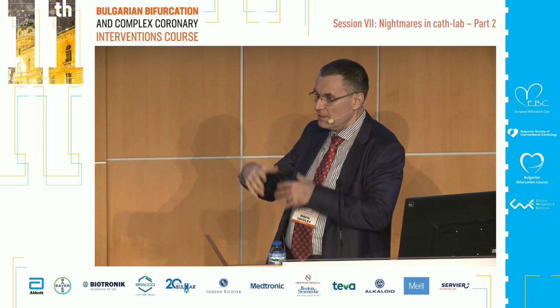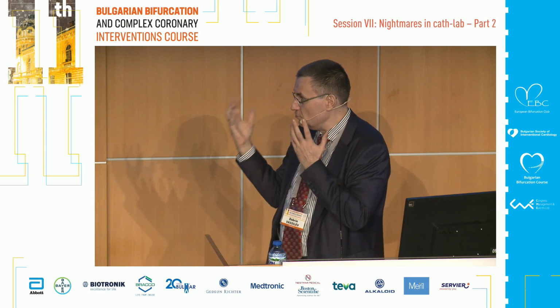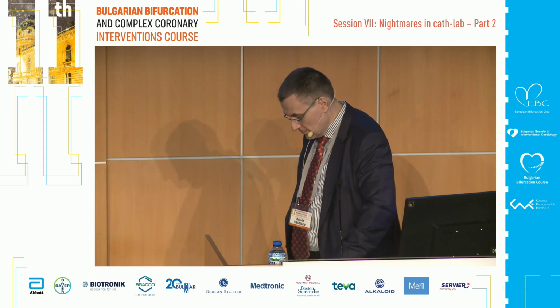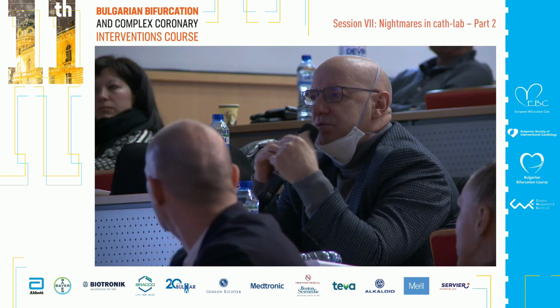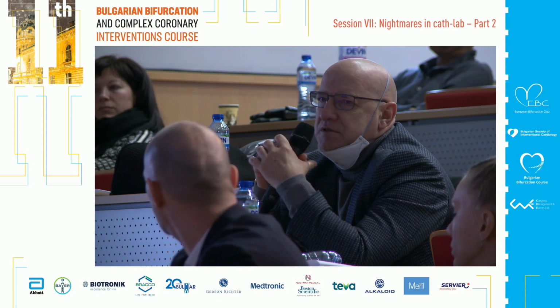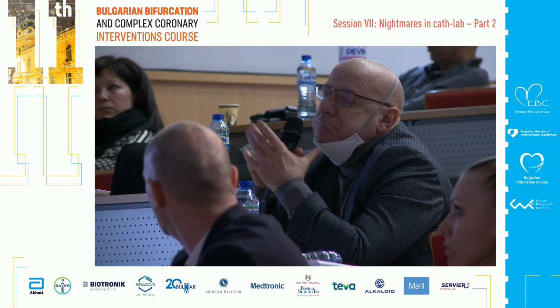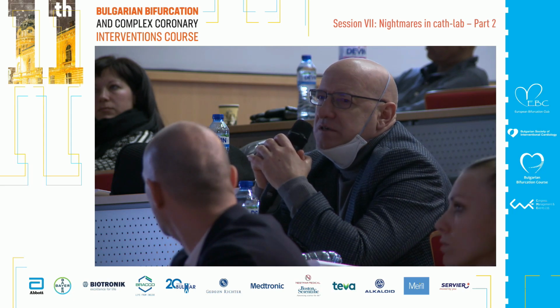and then when we had the flow, she restored, and now you have some time to think what to do. In these cases, you should go distally, make re-entry, and after that smash the subintimal space, connected in many places, with balloons just to restore the flow. And it is very wise you left it this way without stenting. On a second control angio, probably you fix it if necessary.